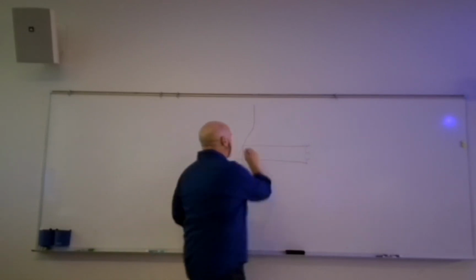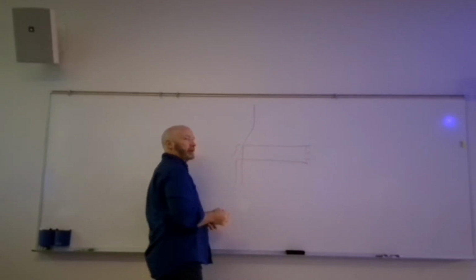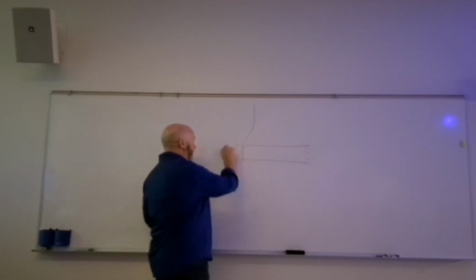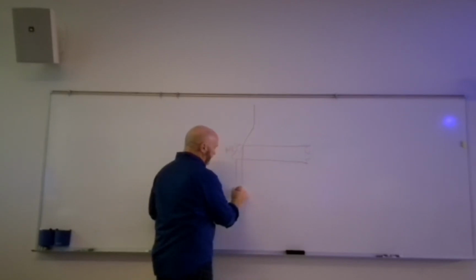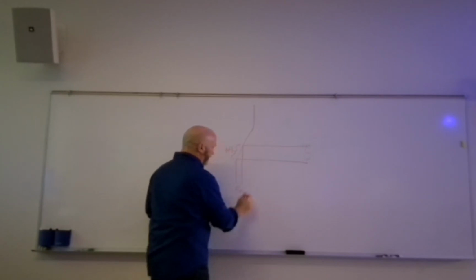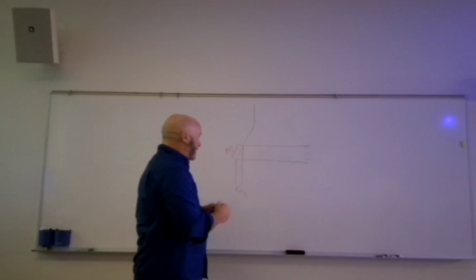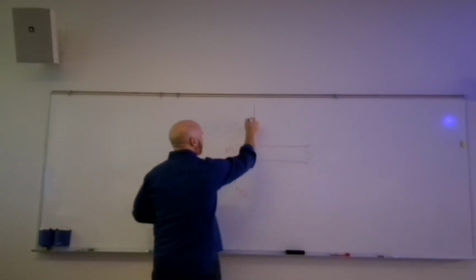So we have a word for this focal spot, and that is a what? Actual focal spot. Right, actual focal spot. This is the effective focal spot or projected focal spot, right? So now let's change the angulation and make it more of a 45-degree angle.